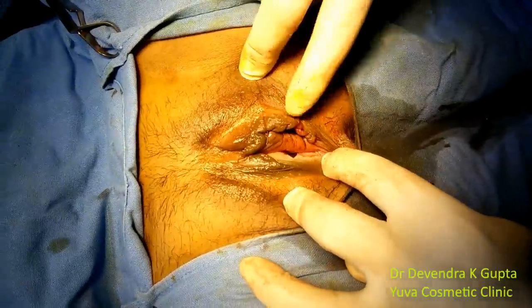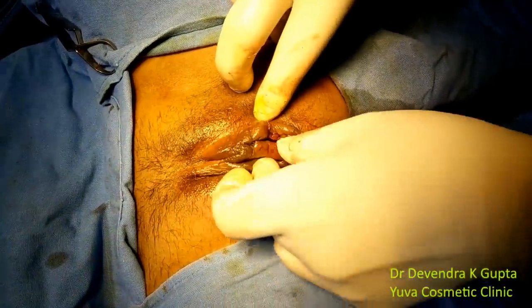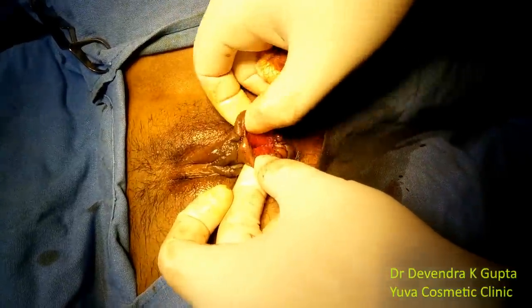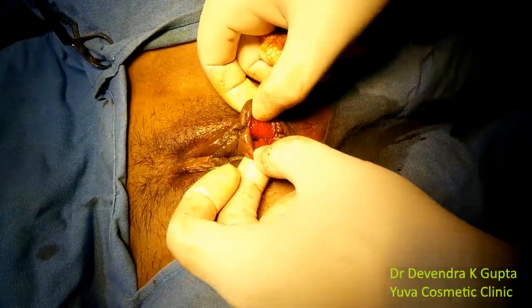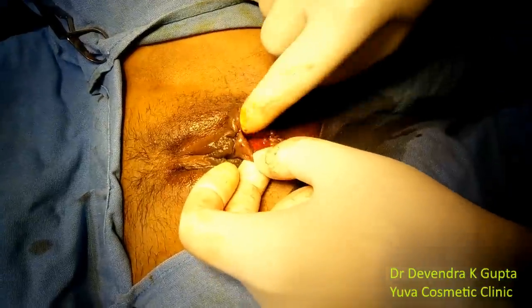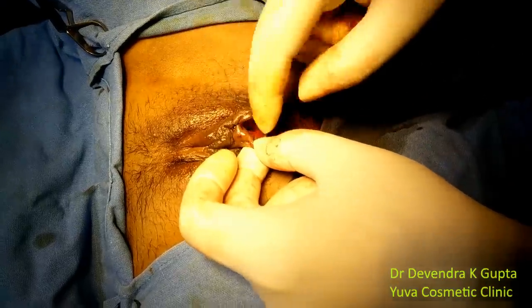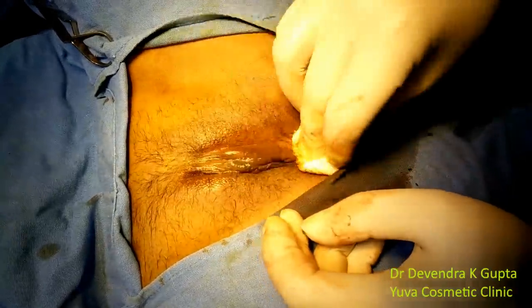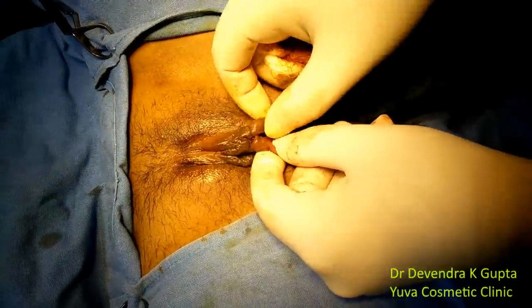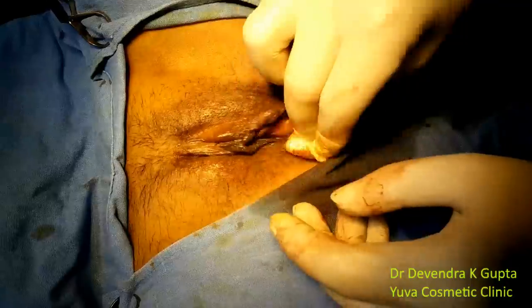I have drained the abscess and curetted the margin of the abscess cavity, and then we have done running sutures at the periphery of the incision line to try to marsupialize it — although the major part of the lining has been damaged in abscess formation and I have curetted the lining also. This is not going to create any deformity, because this wall will stick together, and the operation is complete.